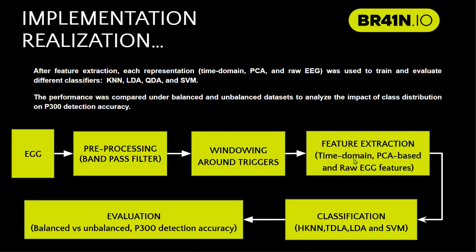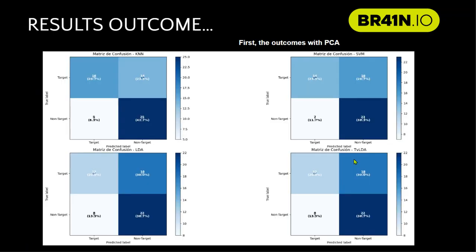We also present here our pipeline of how the information was processed: our dataset, pre-processing, windowing, feature extraction, the implementation of the classifiers, and then at the end, evaluation with performance metrics.